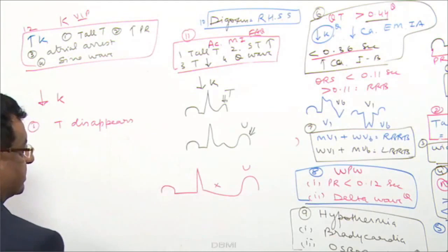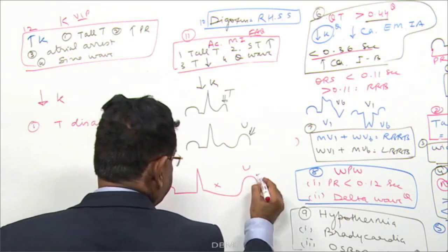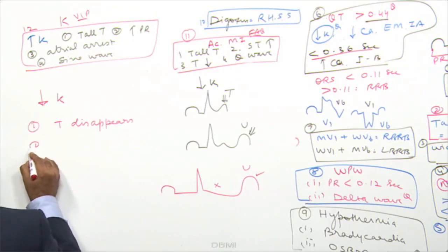Look, T has disappeared, and a prominent U wave has appeared.